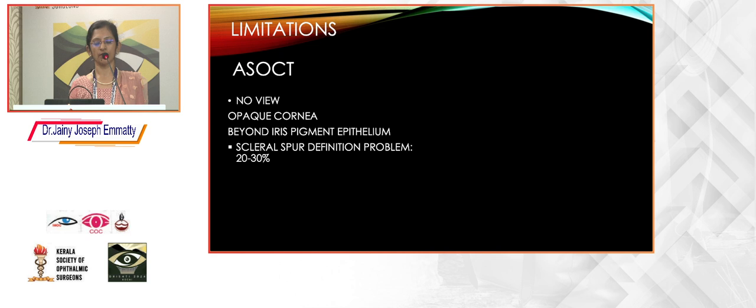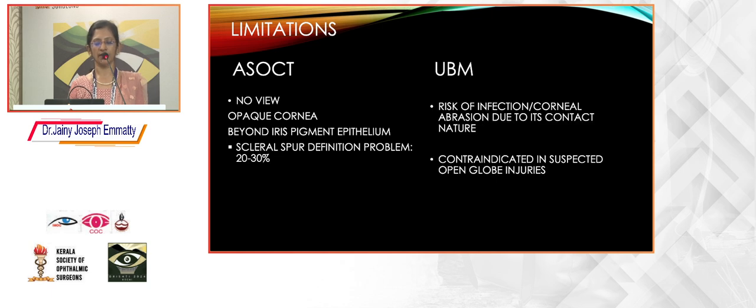Both have their own limitations. There is no view in opaque cornea, and the scleral spur definition problem is still there in ASOCT. With UBM, there is again the risk of infection and corneal abrasion due to its contact nature, and it is contraindicated in suspected open globe injuries.